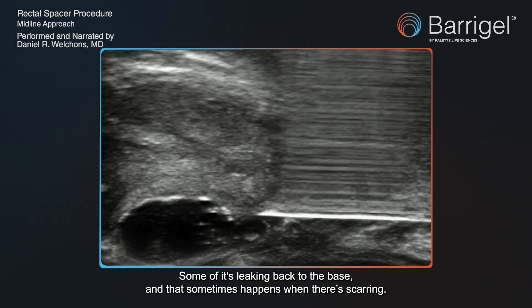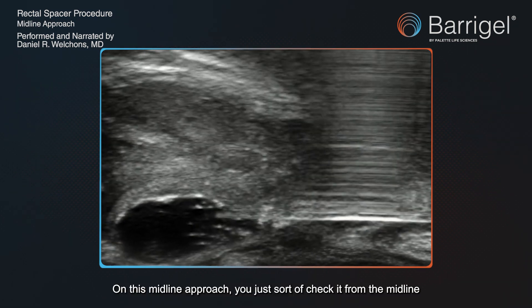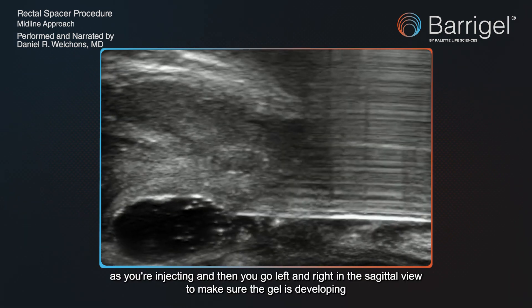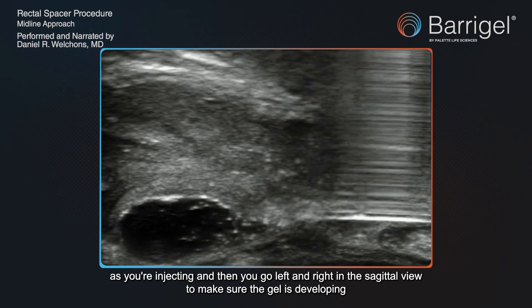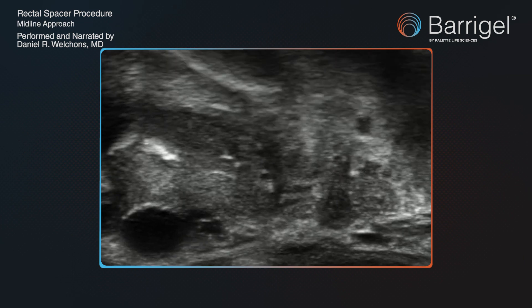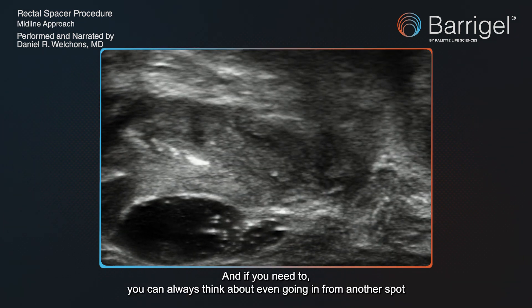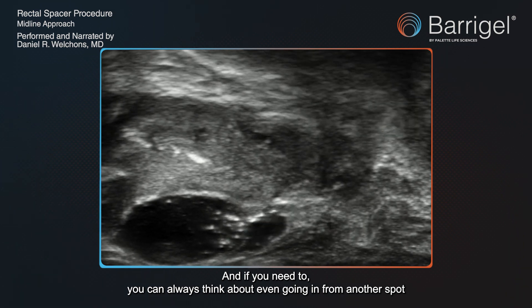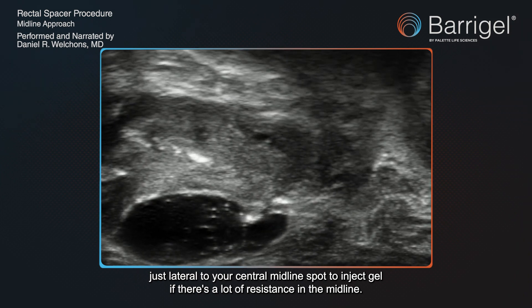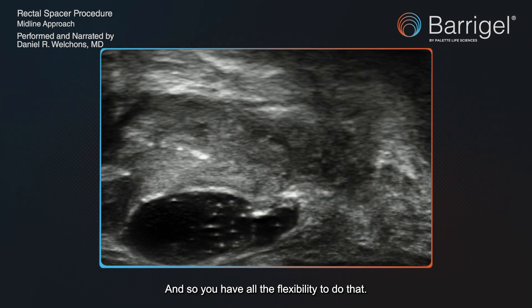Some of it's leaking back to the base, and that sometimes happens when there's scarring. On this midline approach, you check it from the midline as you're injecting, then go left and right in the sagittal view to make sure the gel is developing a symmetrical space. If you need to, you can always consider going in from another spot, just lateral to your central midline spot, to inject gel if there's a lot of resistance in the midline.